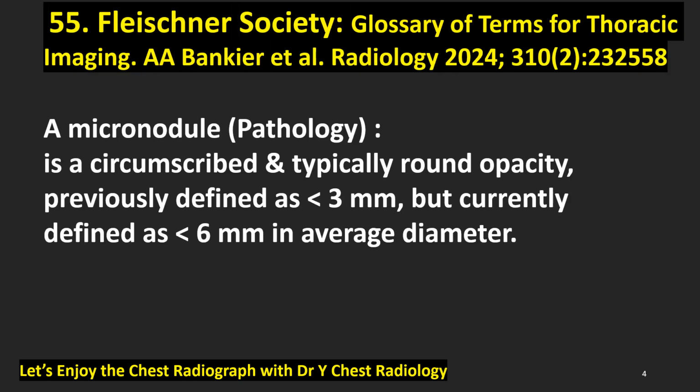In 2024, in the journal Radiology, the Fleischner Society redefined the definition of micronodules. Micronodule is a circumscribed and typically round opacity, previously defined as less than 3 mm, but currently defined as less than 6 mm in average diameter.